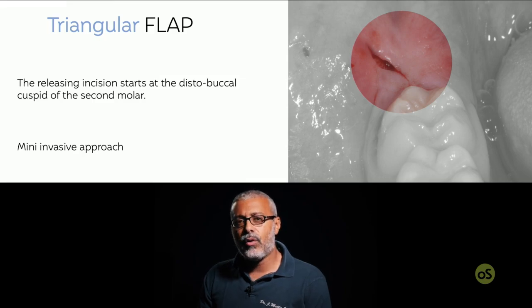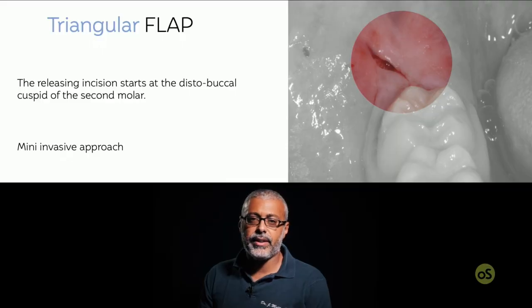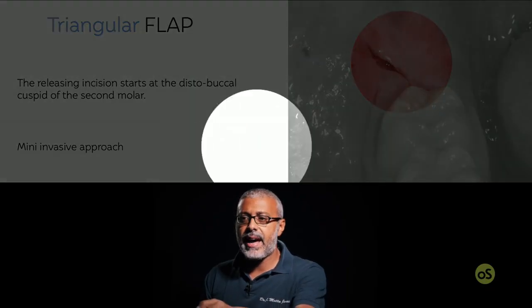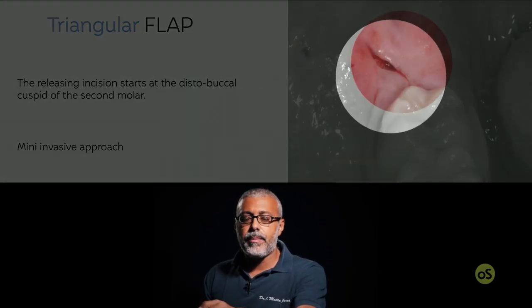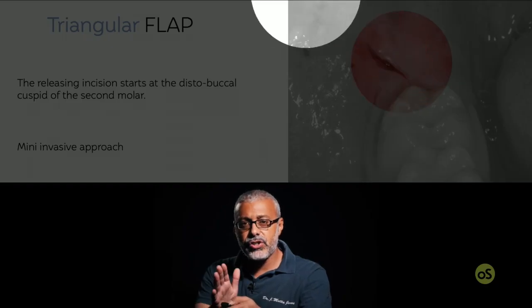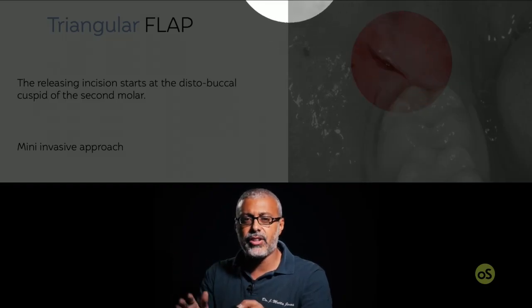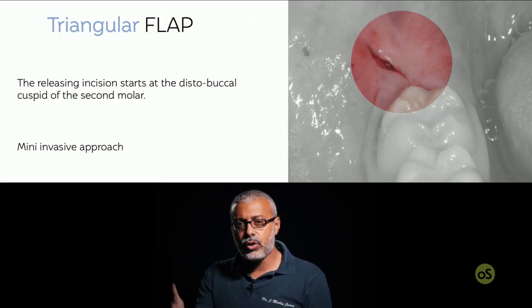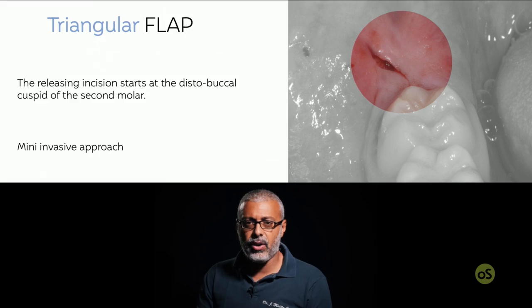This involves the intrasulcular incision on the seventh tooth with a distal buccal releasing incision that goes towards the ramus. We always have to remember that in this area, the bone of the mandible at the ramus diverges towards the external part, and so our incision will have to be directed towards the external buccal area.